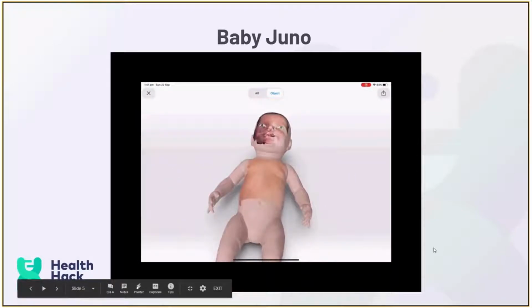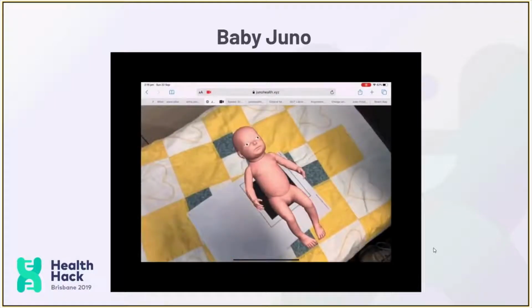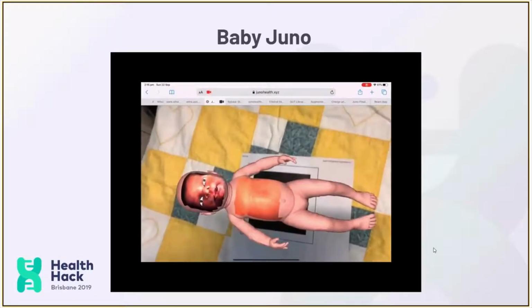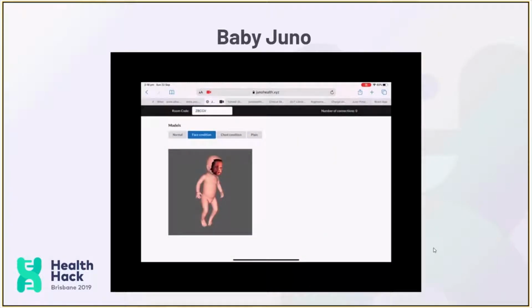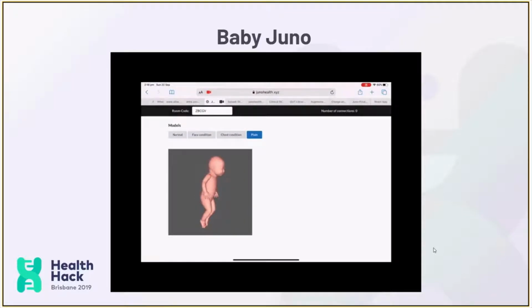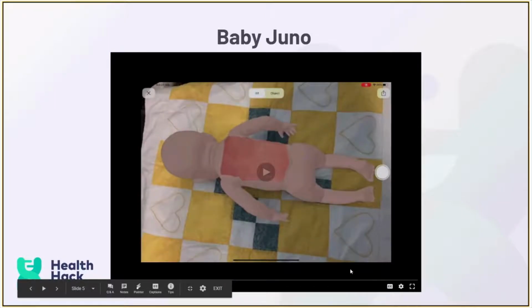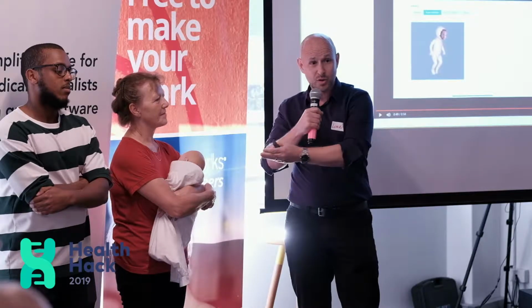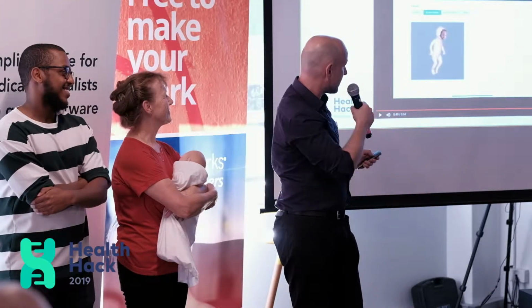And so they're able to use these just on an iPad. They can upload the files. In these remote areas, they don't have access to the internet. And so some of these sites, like Bamaga or Torres Cape, don't have access to the internet, so they're able to just have the files and load them up and swap between them. And this is the browser-based version. So this is the instructor view, and previously we saw the augmented reality view. So they can manipulate the mannequin, and they can see it in the instructor view. So they're able to do, say, from Brisbane, remote training to the people in these remote areas. A lot of the time the experts, like Sue here, are in Brisbane, and it's expensive to fly them out to these places.